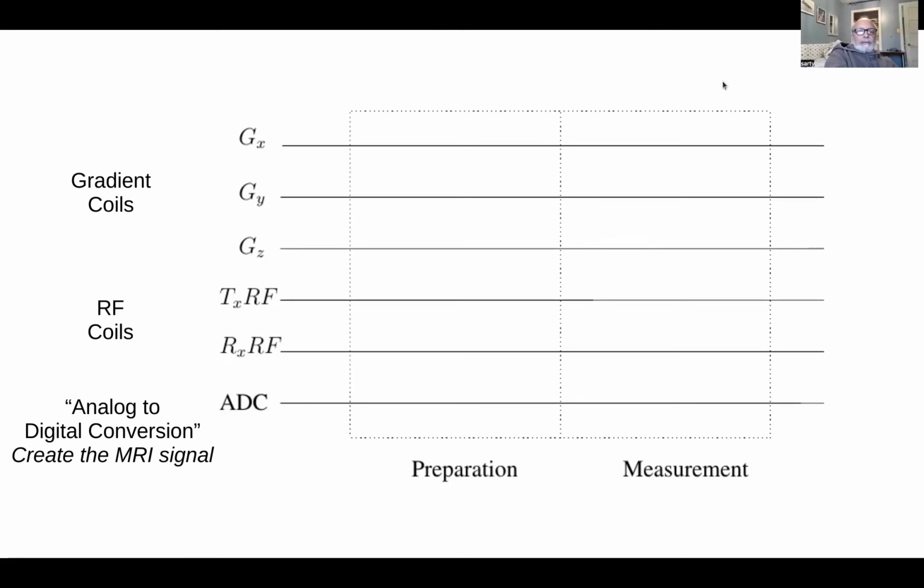So probably Holly would have introduced to you these different channels that you need to essentially define functions for. So going left to right across the page here, the axis is time. And I've shown 6 channels here.